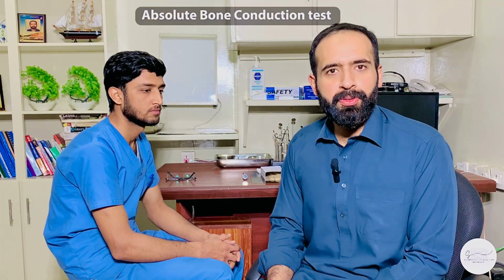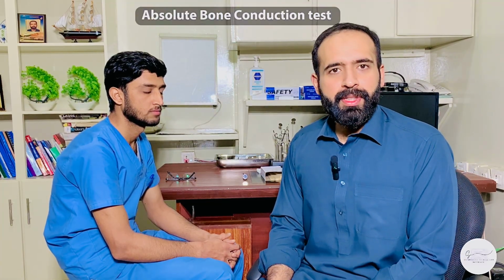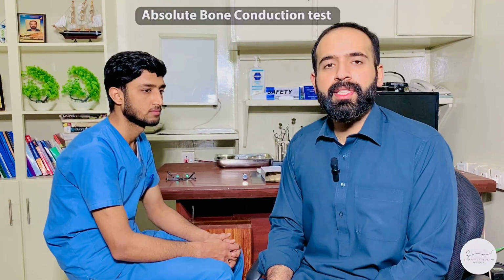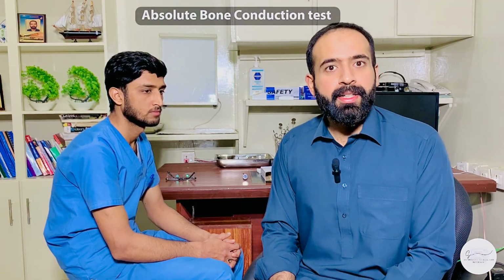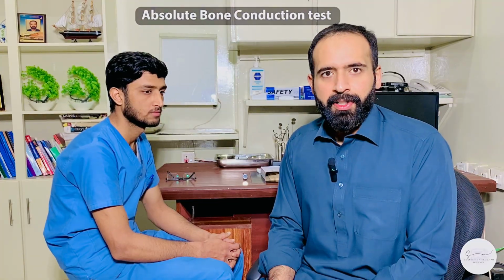For the postgrad students, another hearing test that needs to be done after Rinnie's and Weber's is the absolute bone conduction test. Absolute bone conduction test is used to diagnose sensorineural hearing loss if your Rinnie's and Weber's are indicating a sensorineural deficit. So in order to do the test, first you educate the patient.